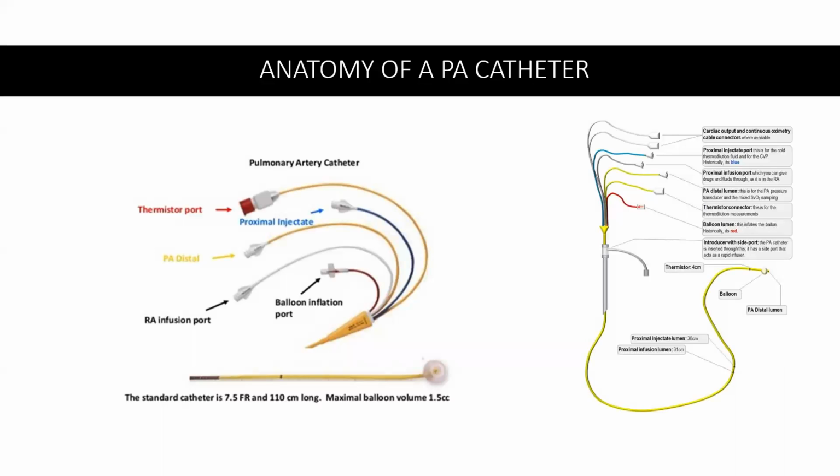All right. Let's try to understand this catheter, because that's basically what you're going to be focusing on in your interventions as far as assisting in its insertion, as well as in the care of these patients. There are several designs of a pulmonary artery catheter, ranging from a simple catheter that measures PA pressures to complex multiple lumen catheters that also measure cardiac output and other variables.